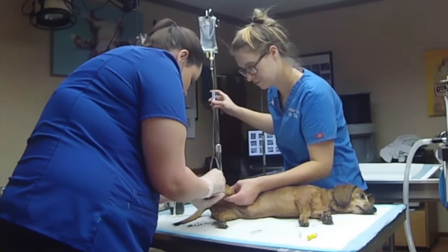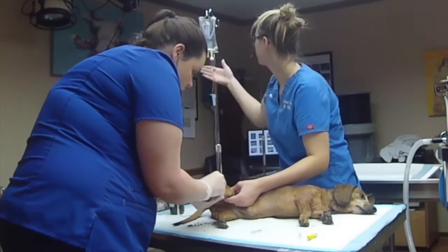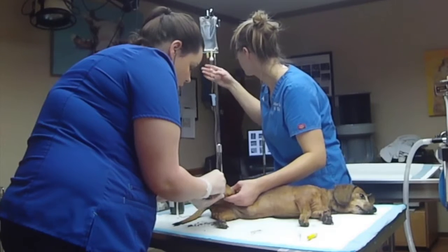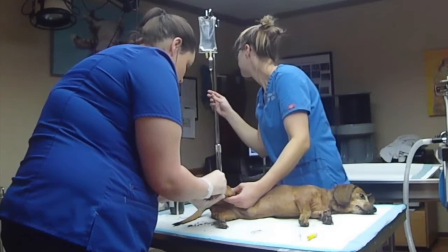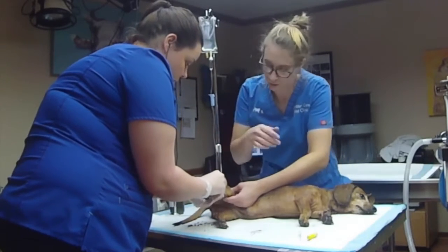To know whether it's patent or not will be whether it bleeds. Yes. If you hold the lid. Yep.